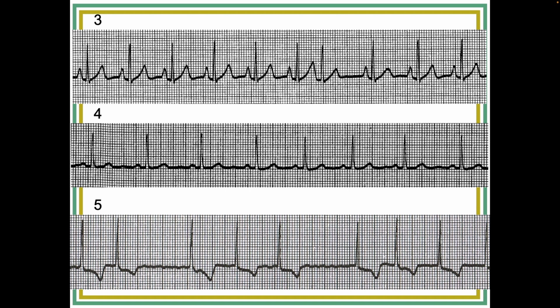Okay. R to R's, what do you say, are all matching? Regular. Or if you want to be really precise, you'd say the ventricular rate is regular, if that's all you measure. Okay. So put it together, and what do you got? Normal sinus? Yeah, this is normal sinus.